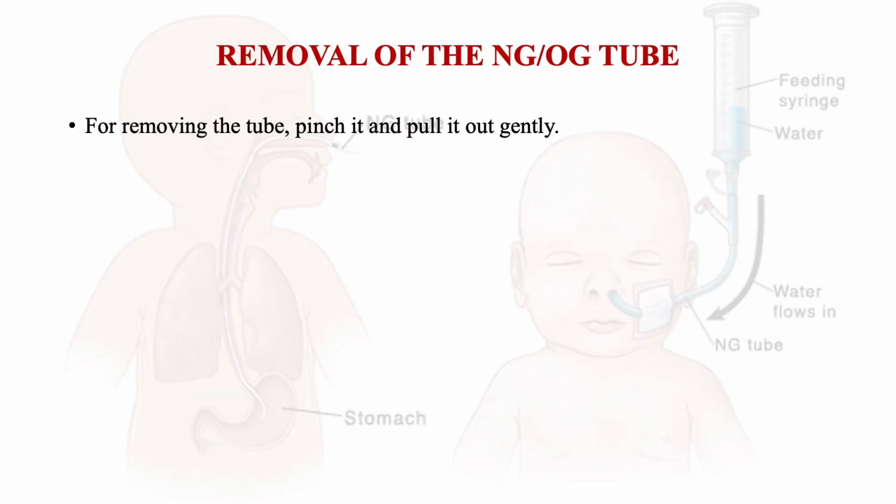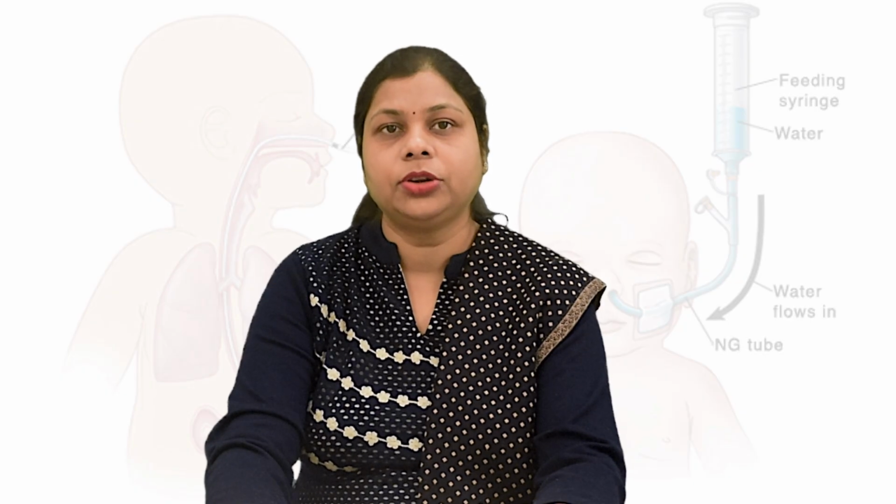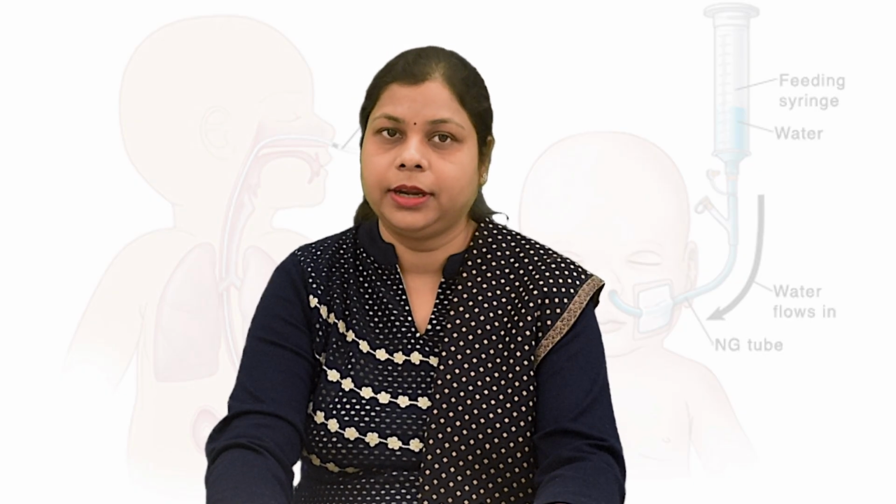Talking about removal of the nasogastric or orogastric tube: for removing the tube, pinch it and pull it out gently. So this is all about the procedure of nasogastric or orogastric tube insertion and feeding.